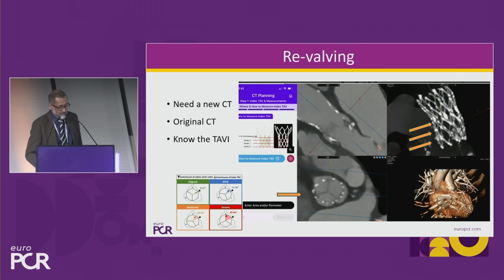And of course, there's alignment with the commissures and, more importantly, alignment with the coronaries, as the point's been made already. We need to know that the coronaries have a leaflet in the way if we're going to leaflet modify, because if there's a post in the way, no leaflet modification will really help. So that's why I think increasingly, as we get a younger population, trying to align, as Simon pointed out, we actually achieved a pretty reasonable alignment in this case, is going to be more and more important.